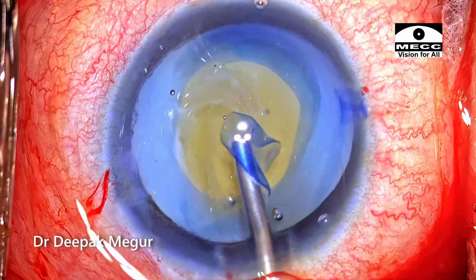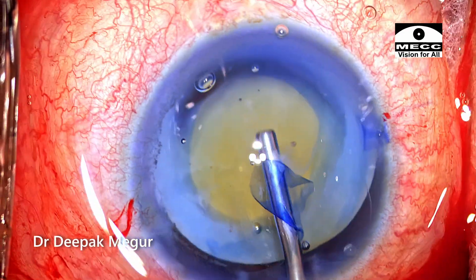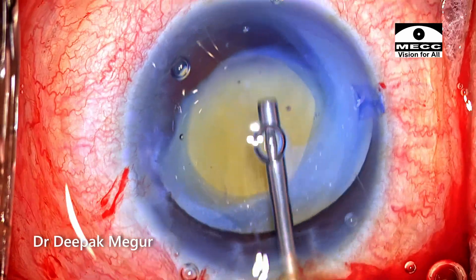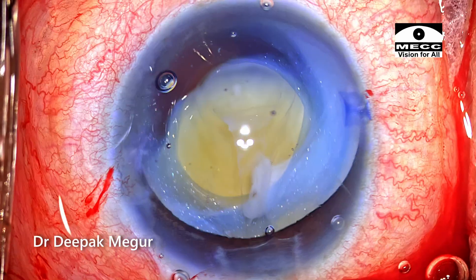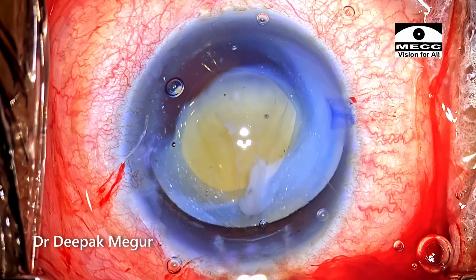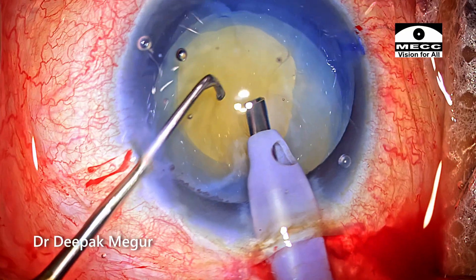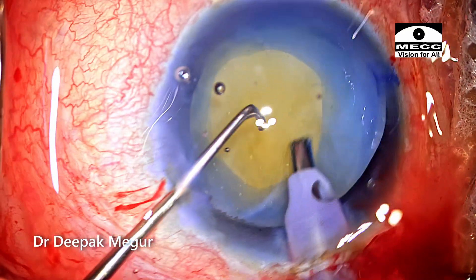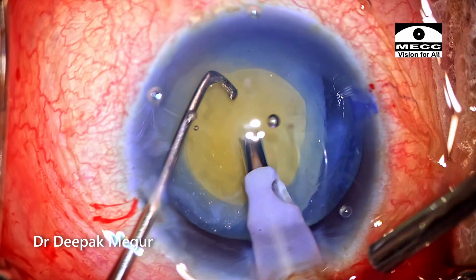HPMC is injected under the dispersive OVD before beginning the phacoemulsification. Since this is a free floating nucleus and these hypermature small nuclei will also be slightly denser, for this case I have specifically chosen to perform a horizontal chop technique. I'm using a long horizontal chopper.